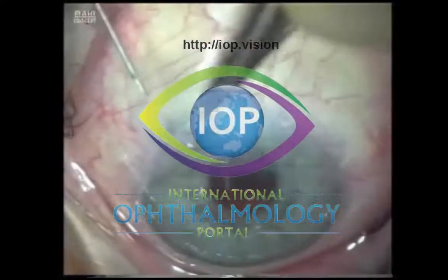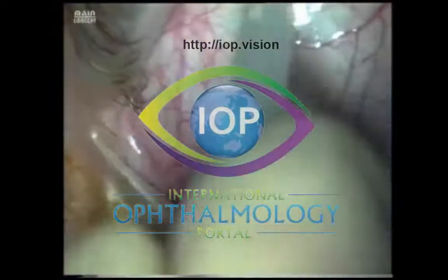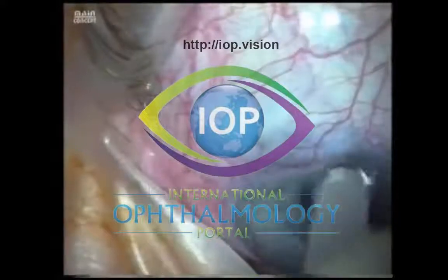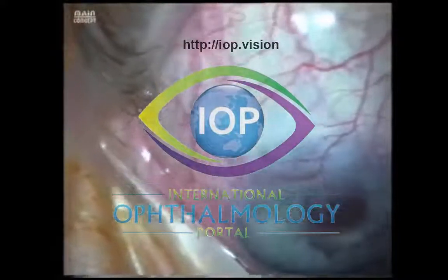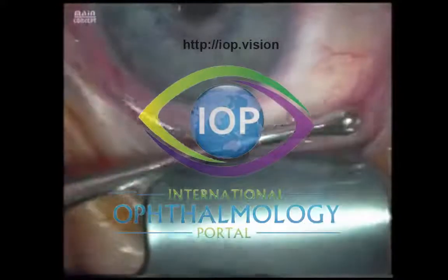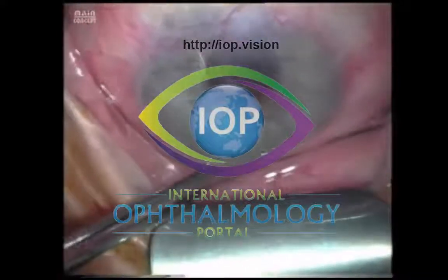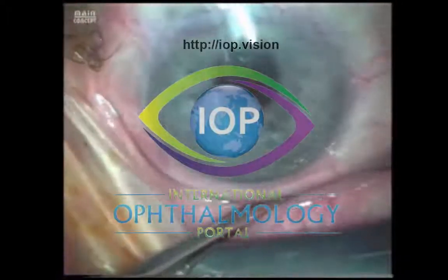Nowadays I tend to use a simple triangular sponge to infraduct the eye where necessary, which is a little bit less traumatic for the inferior conjunctiva throughout the procedure.